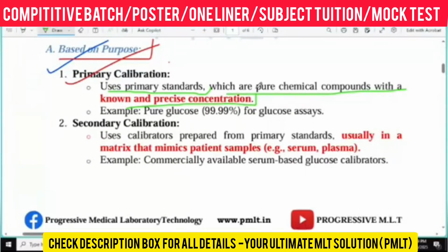Getting my point? Primary calibration means firstly you have to use the pure chemical concentration, as well as the primary standard solution, for running the primary calibration. Like if I give you the example of glucose, that is 99.99% pure glucose. So we are saying that the standard of glucose is 100%, right? So that is the primary calibration.